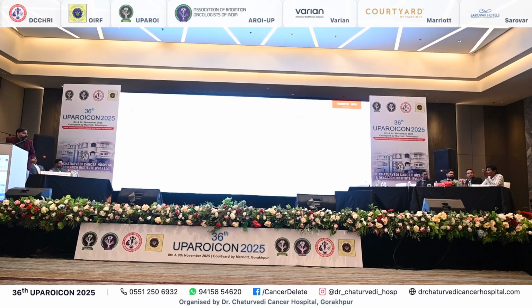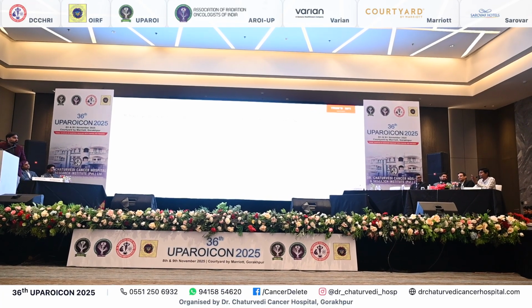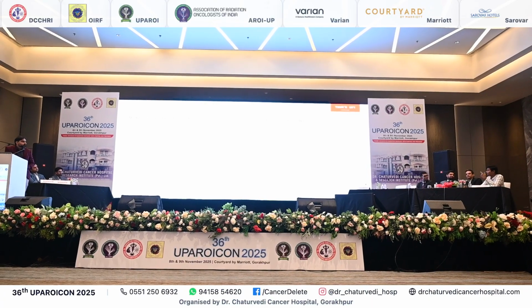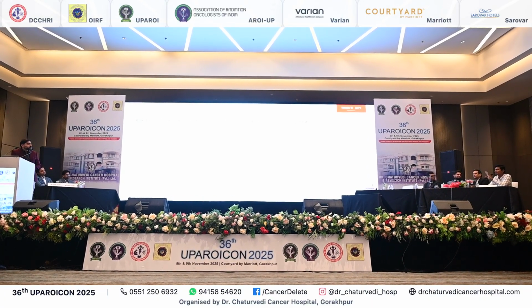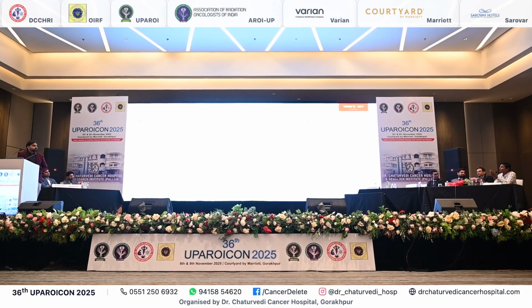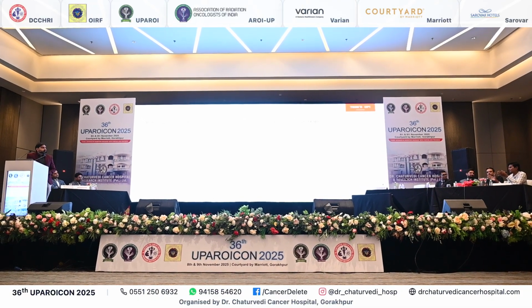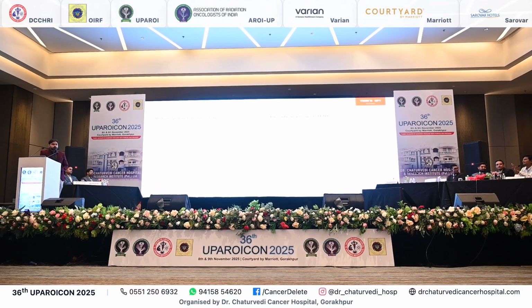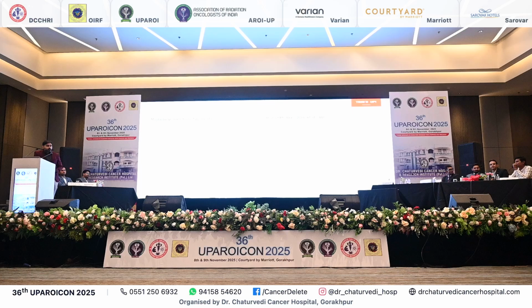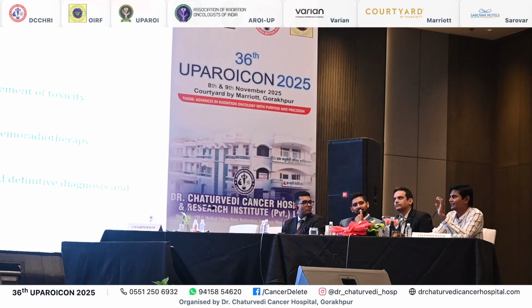Less than 50% of the dose spillover is sufficient to blast the ovaries. 1 fraction of 6 gray is more than sufficient to knock down the ovaries. In spite of our best contouring, the spillover is more than sufficient, so there is a high chance of knocking them down.